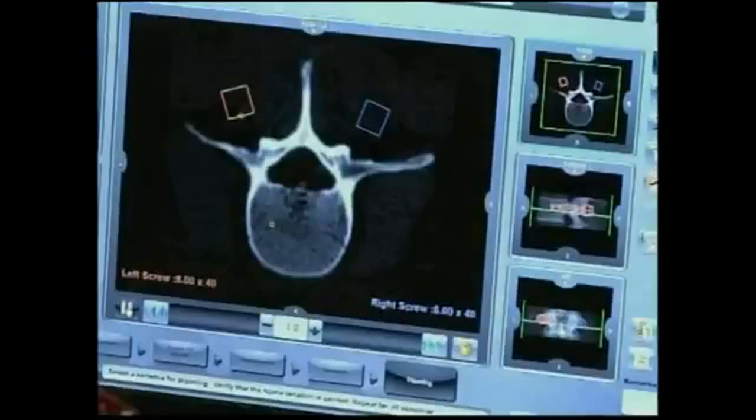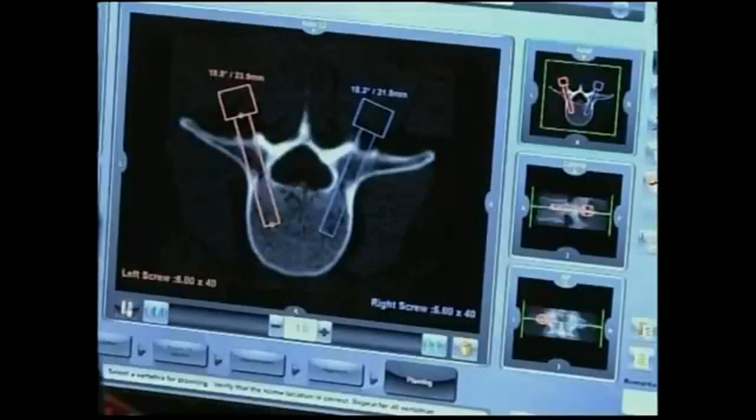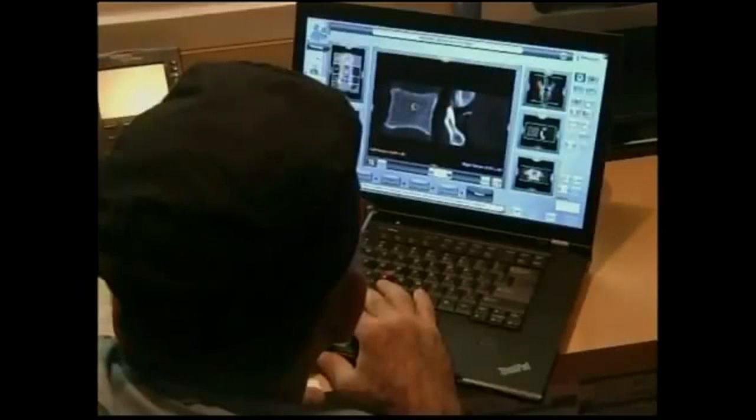The robot aids in the insertion of these screws with precision. Before the procedure, detailed scans are taken, giving surgeons a 3D look at the spine — something never seen before. The info is sent to the robot.